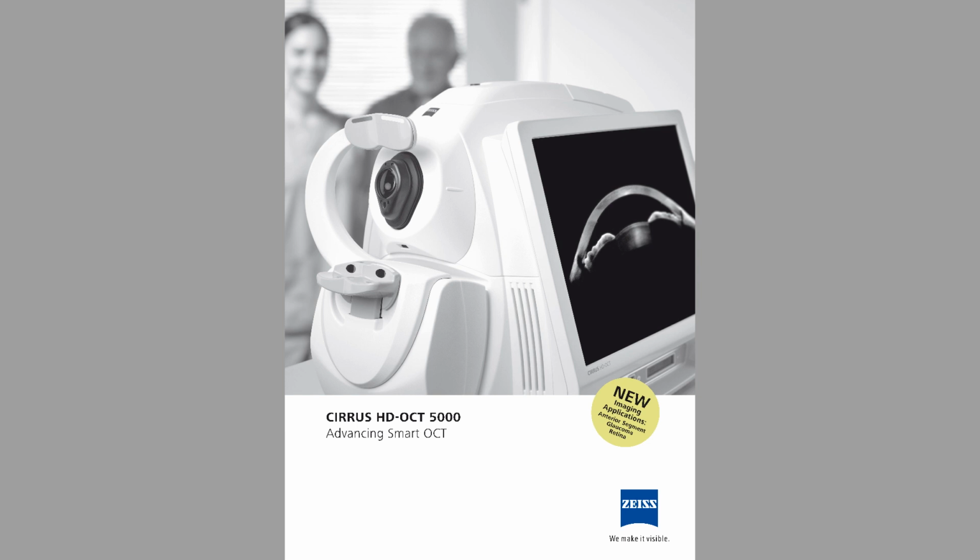If you did the whole enchilada, sure, you could take much longer. It really depends on what you're trying to accomplish, because there are tons of different scans you could do. But as a practical workflow, you might take a macular cube, and you might even take an optic nerve cube just to have that full picture. Then if you were really interested in seeing the vasculature, you could take perhaps a 6x6 angio scan. That would be the whole enchilada at that point. And if you wanted to zoom in, you could take a smaller 3x3.